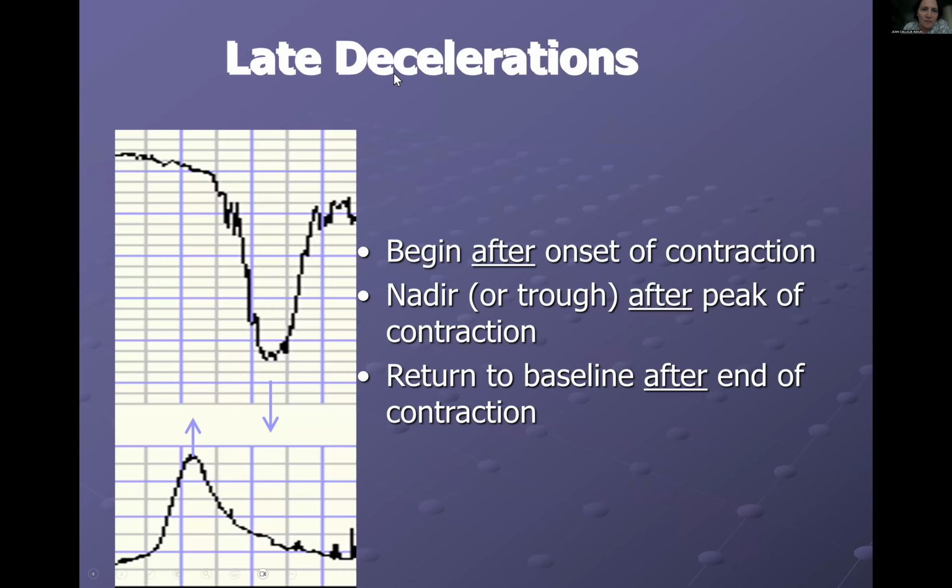So this is what I mean by late deceleration. You've got the contraction here, and the peak of the contraction definitely precedes the deceleration. So the deceleration comes practically as the contractions go away. And it's deep, it's prolonged, okay? So that is a late deceleration. And that does show that there might be hypoxia.